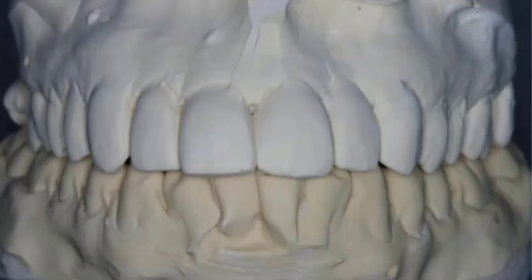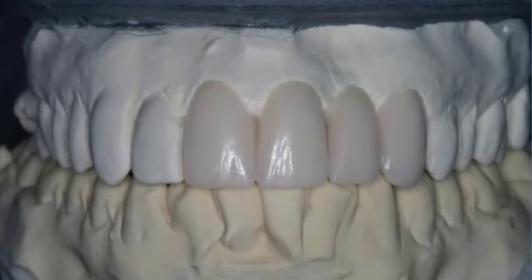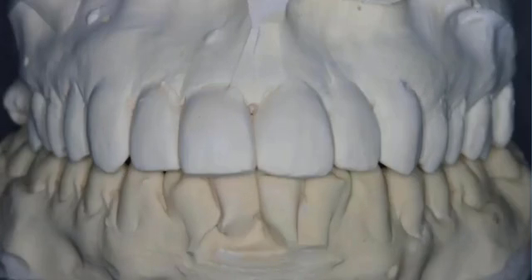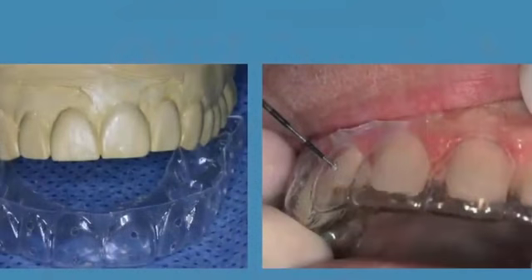So in this particular case, we started with a pre-op model, and we ended up here, based on what the imaging showed for this patient. From that diagnostic wax up, we make a preparation guide.